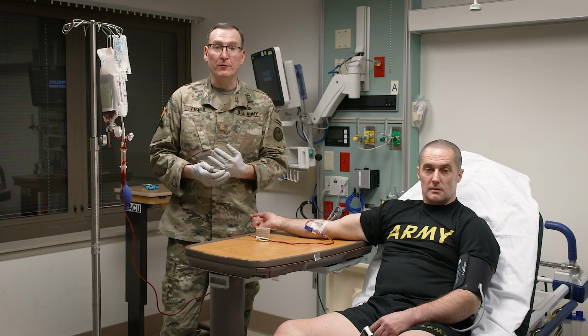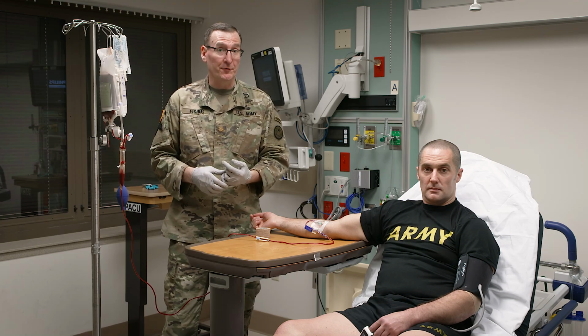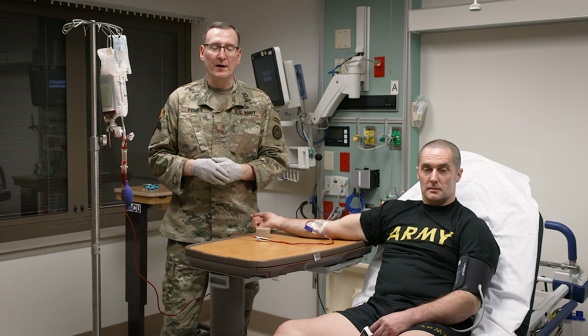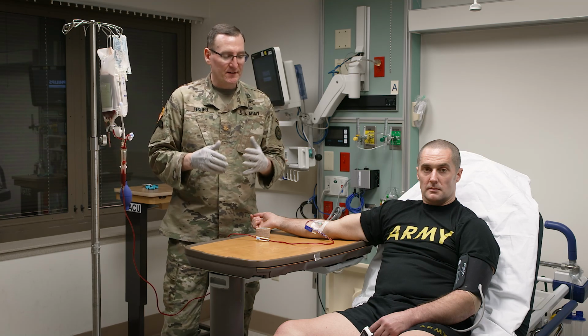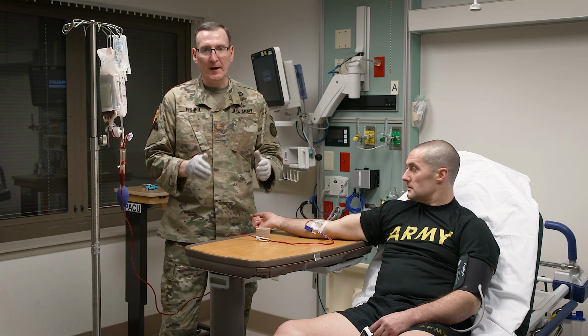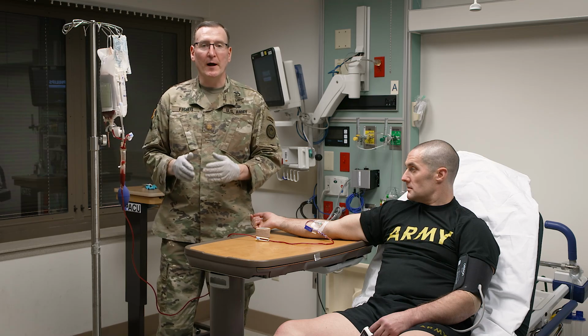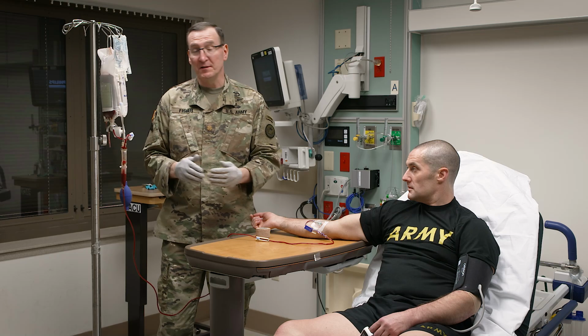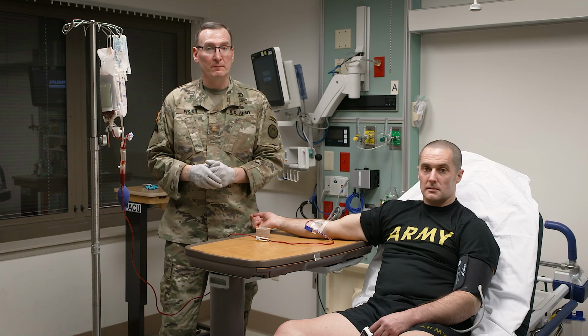I'm also looking for my patient to respond to the blood transfusion, and I'll continuously refresh the vital signs as needed to make sure that I see this response that I need. And that's going to help guide me overall on how often or how much blood I need to transfuse to my patient before he or she is evacuated from the battlefield.